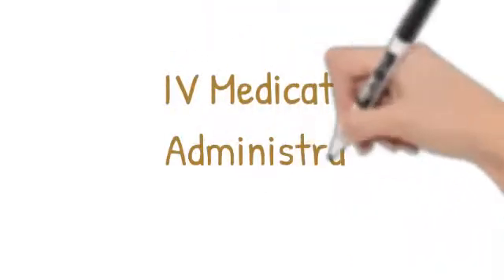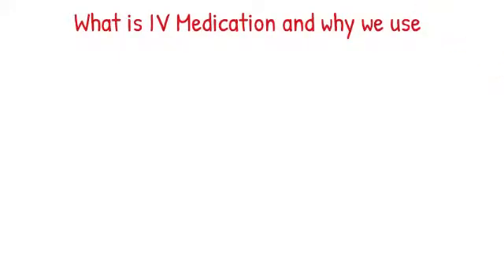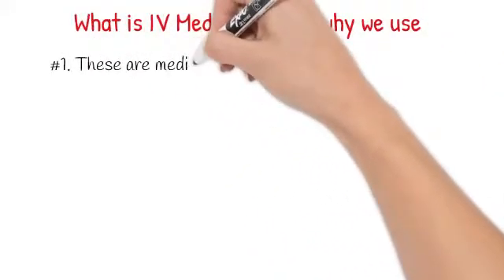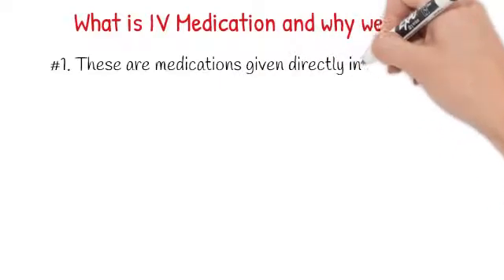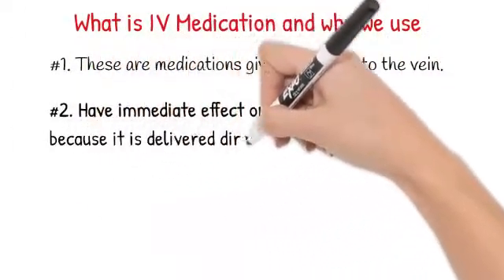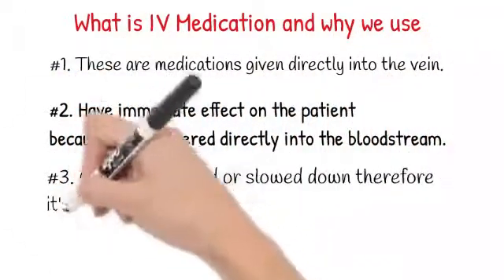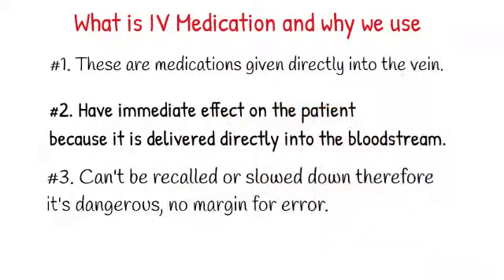IV medication administration. What is IV medication and why do we use IV medication? These are medications given directly into the vein. They have immediate effects on the patient because they are delivered directly into the bloodstream and can't be recalled back or slowed down. Therefore, it is dangerous.